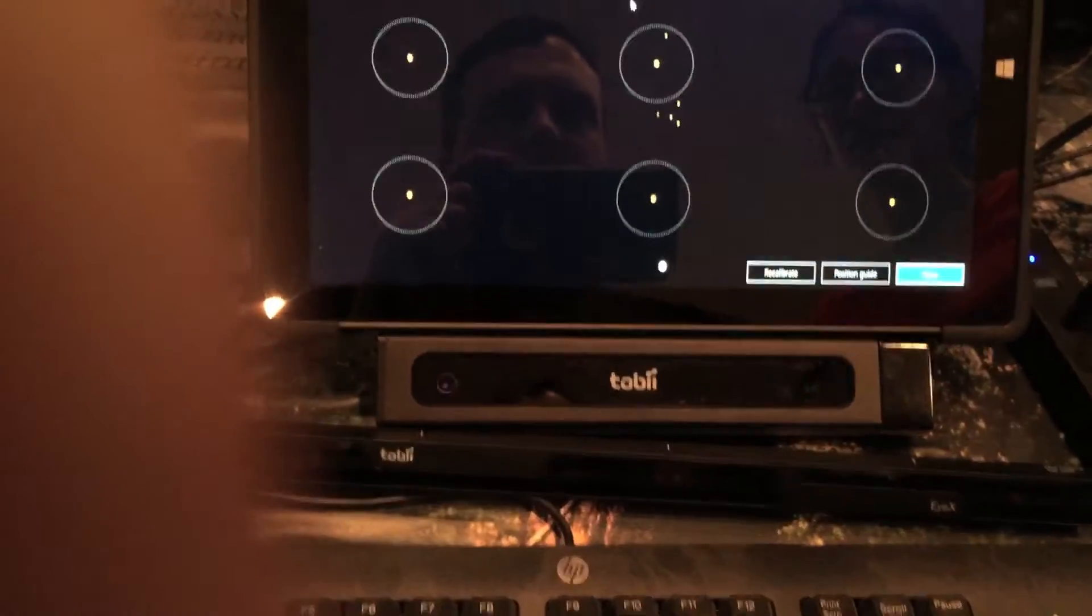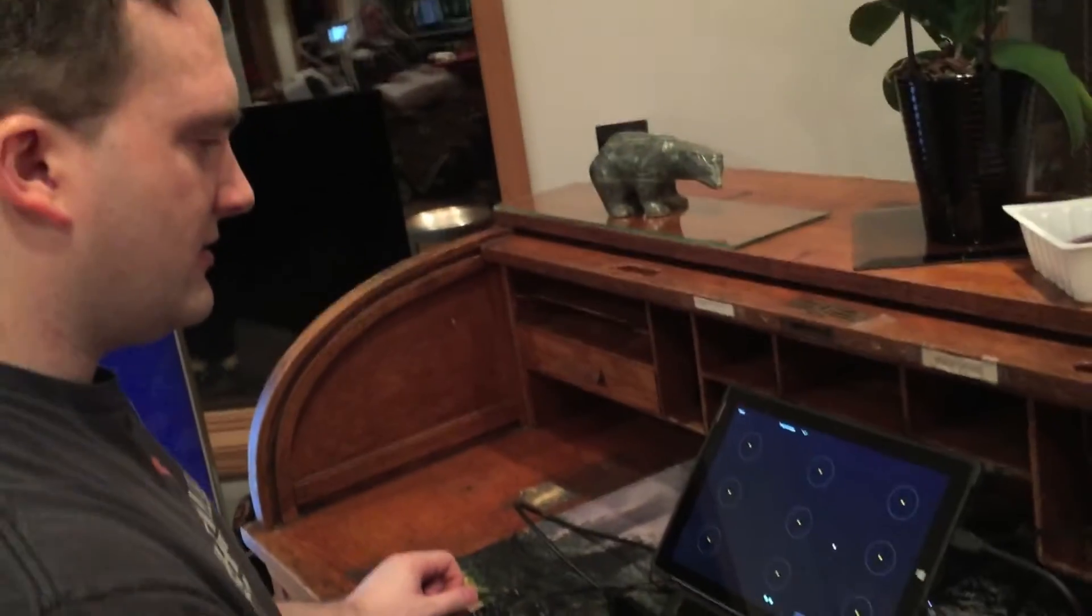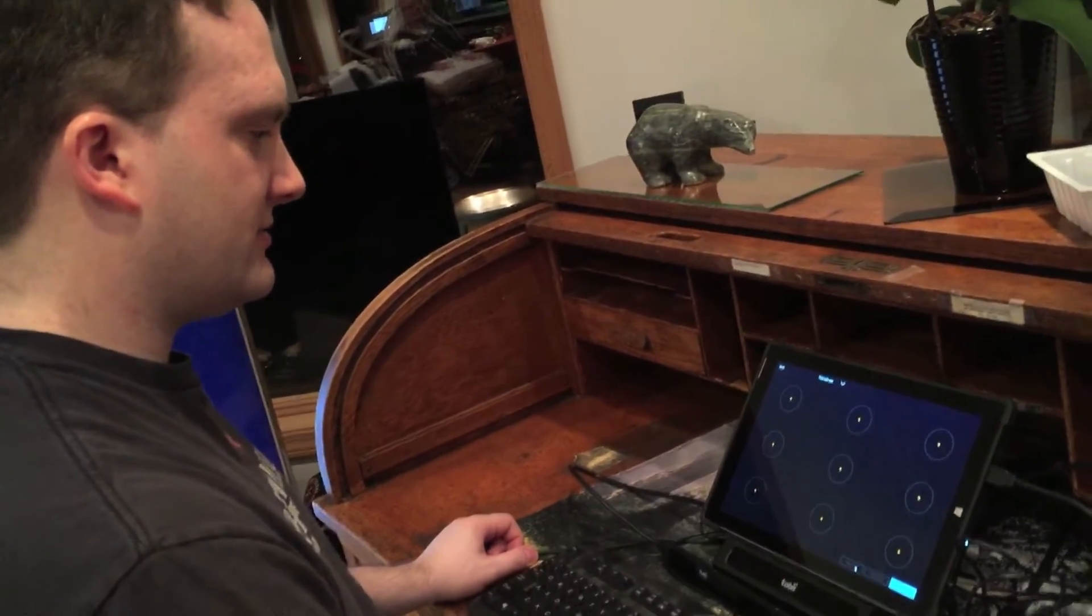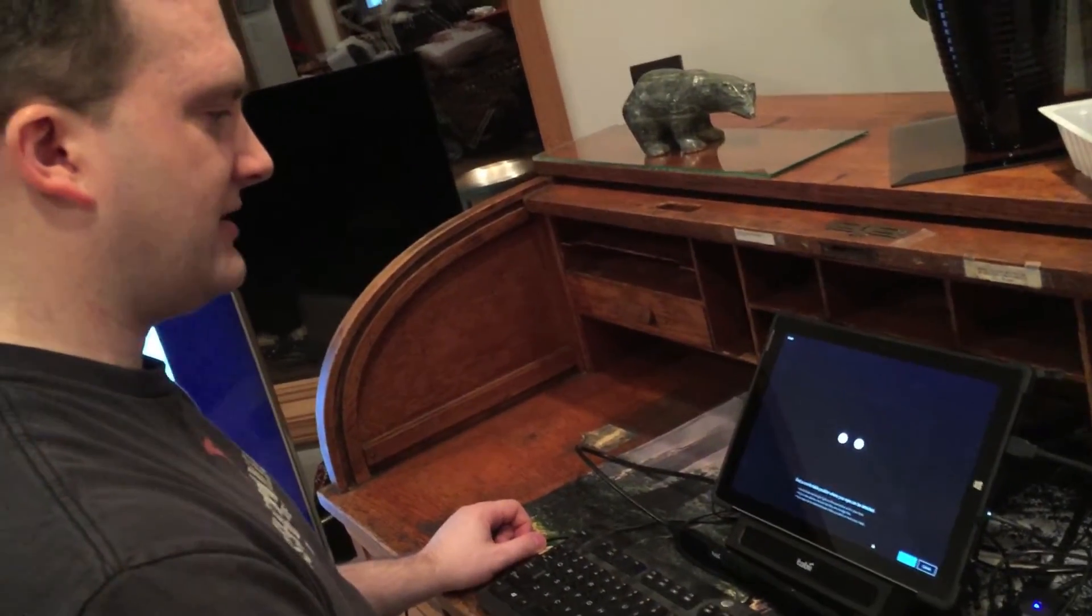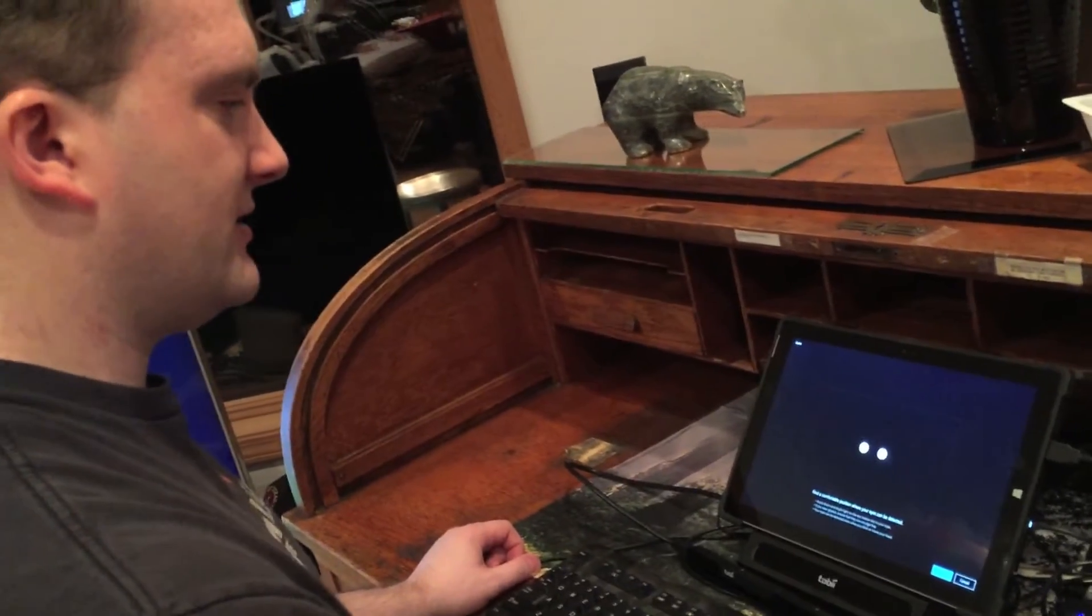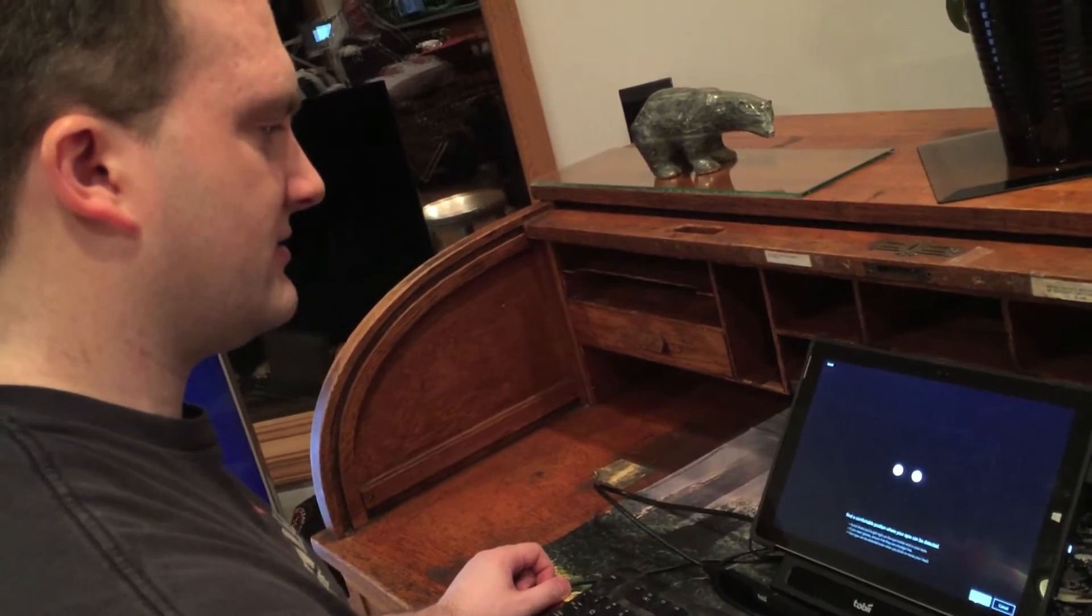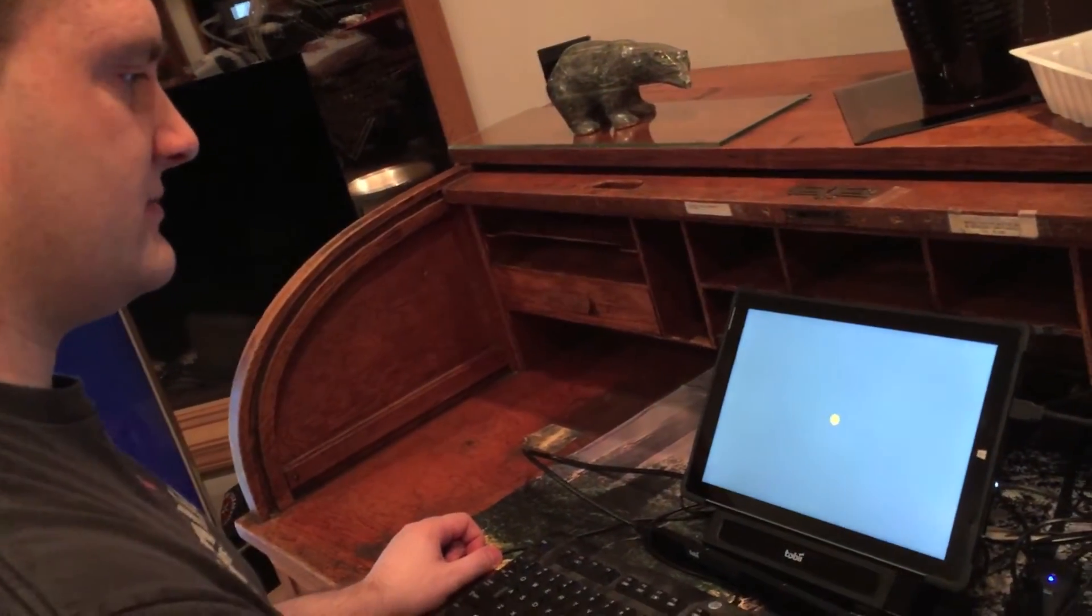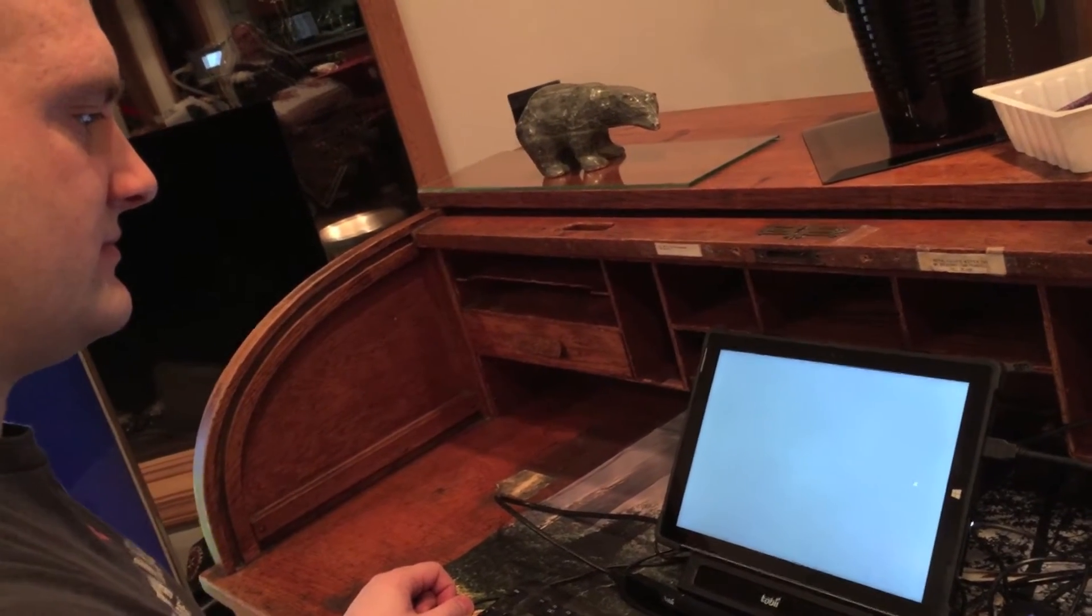So here, let's do the calibration for the PCI. Now, what we'll do is click recalibrate. I'm pretty much smack dab in the middle of the track box. I've got both eyes visible, and they're both pretty stable, so we'll click next. I'll follow the dot with my eyes. Alright.